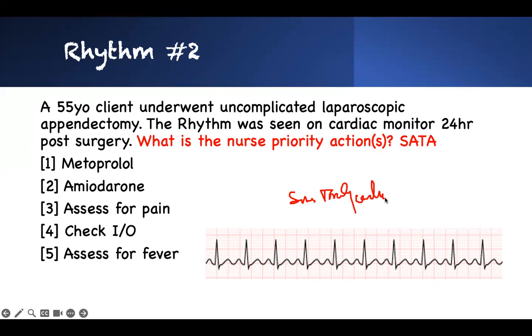This is a very tricky question. It can trap you. Every time on your boards you see sinus tachycardia, never treat it with medication. Until you know what it is, medication is a wrong answer. There's a reason why a person's heart rate goes faster, and it's sinus tach. QRS is fine, the P wave is fine, the interval looks fine, except the rate. I don't see anything worrisome. The shape looks okay. Sinus tach is always a manifestation of something bad happening. So don't treat it with medication now. Number one thing you do is find the source. What is causing the patient the problem? Therefore, medication is never an answer choice.